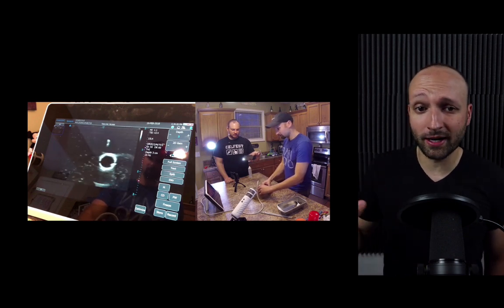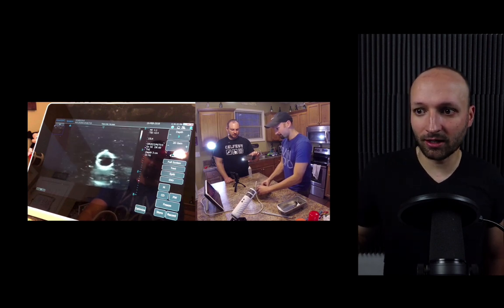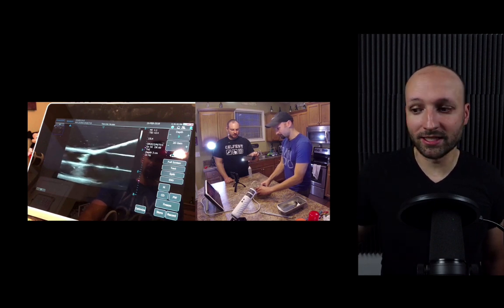Commercial simulators are great, but if you want to create one for a little bit less money and reusability at your house, you can definitely do it with Knox gel, ballistics gel, and there are a bunch of other ways that you can do it.